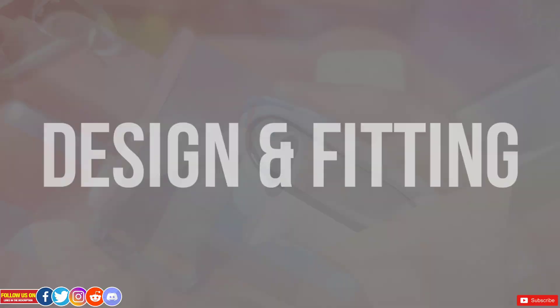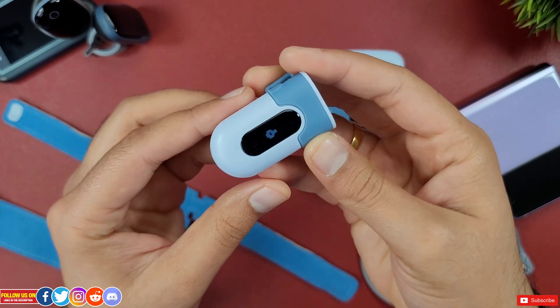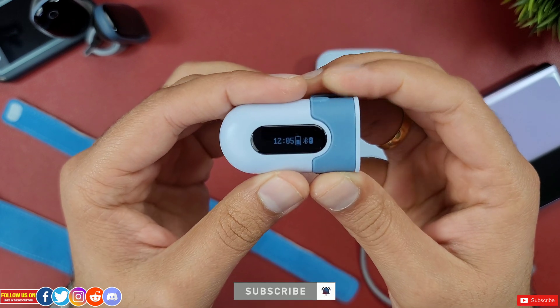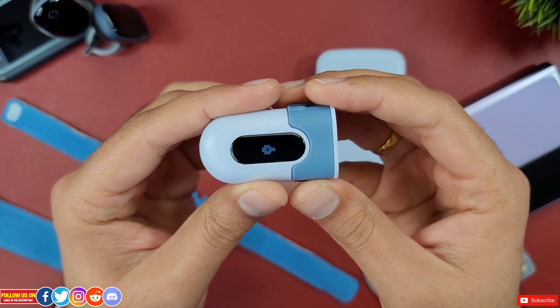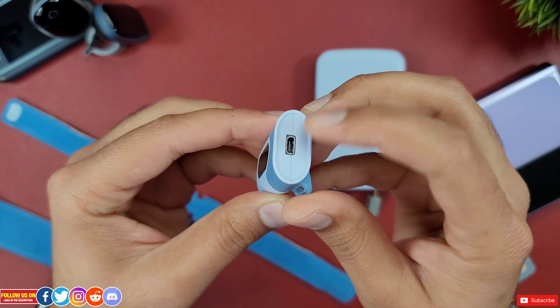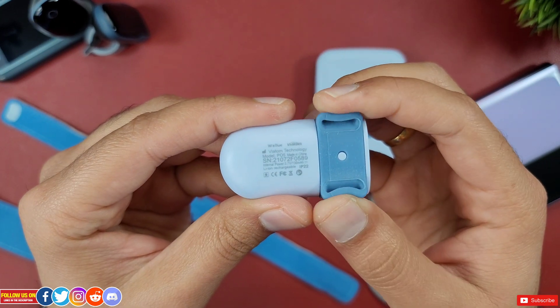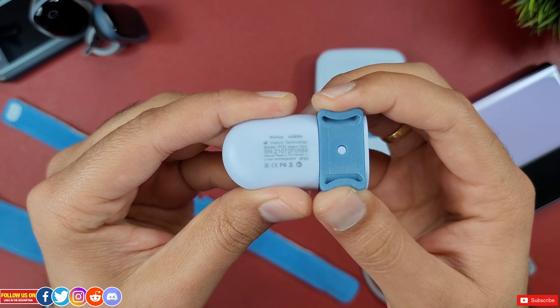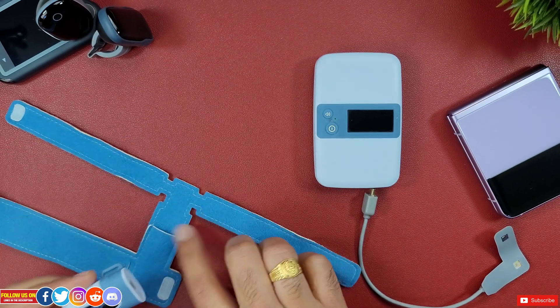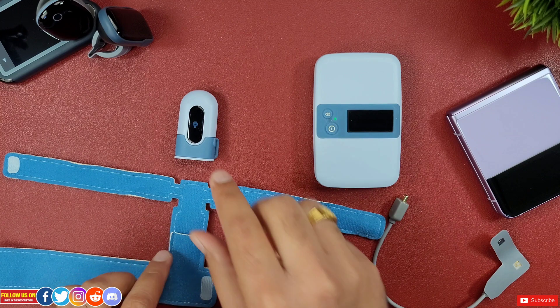Now let's talk about design and fitting. The device is very tiny and super lightweight. It has a tiny display showing heart rate and SpO2 readings, a power button on the side, and a data/charging port at the back. There are two strap loops where you can slide in the soft ankle wraps or the split wraps.